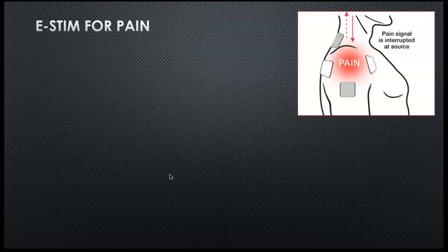All right, e-stim for pain. So those are all the ones for muscle contraction. Now we're moving into different types of electrical stimulation that you would use to control pain.